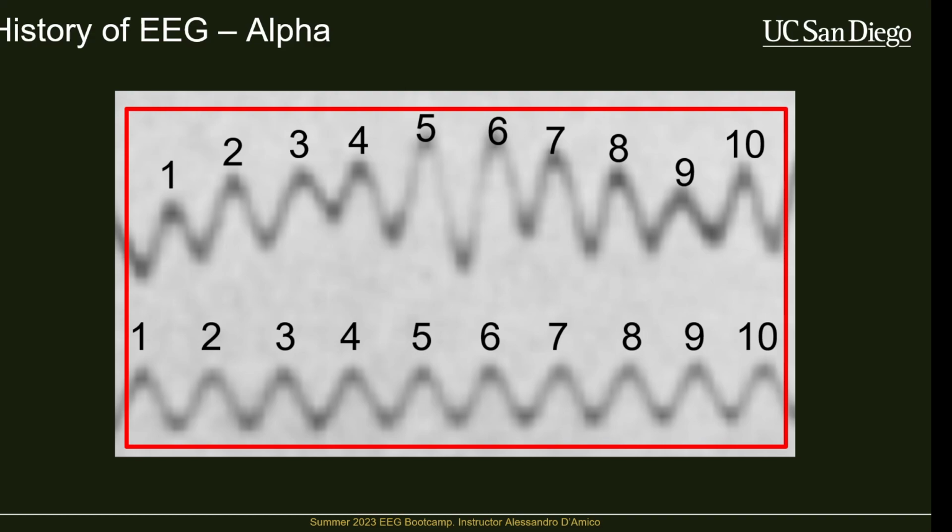Each and every one of you is going to record an alpha oscillation just as part of the setting up, because it's a very easy thing to generate. All you have to do is put electrodes over the occipital cortex and then close your eyes and relax, and you'll see some alpha activity increase. It's not big in everybody, but it should be there for everyone.